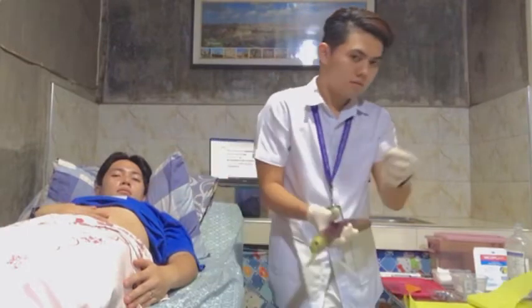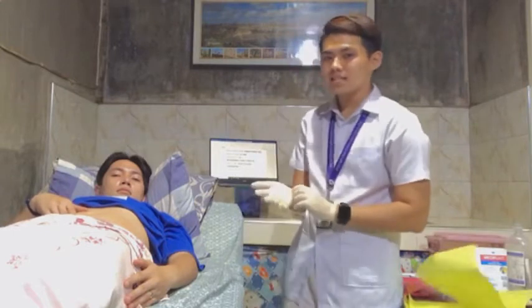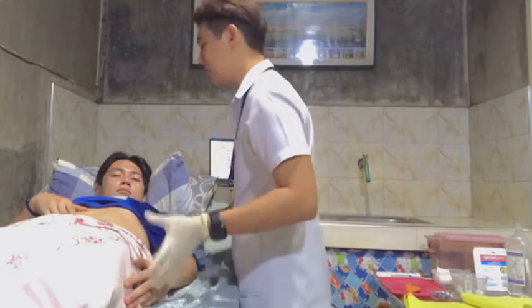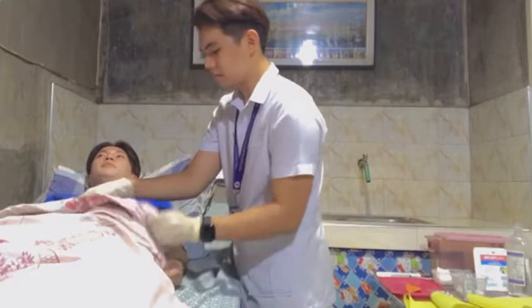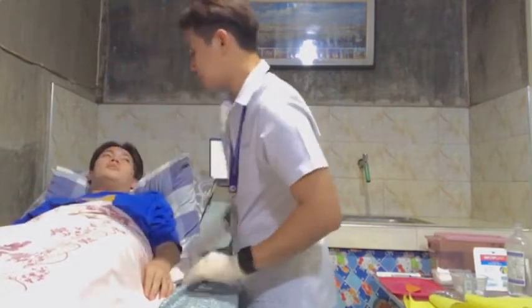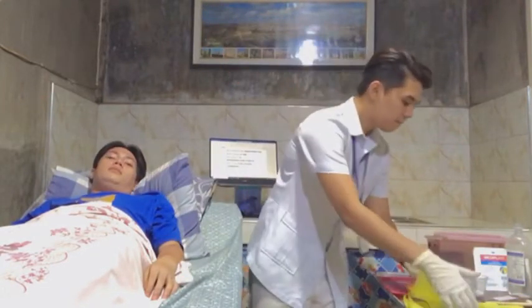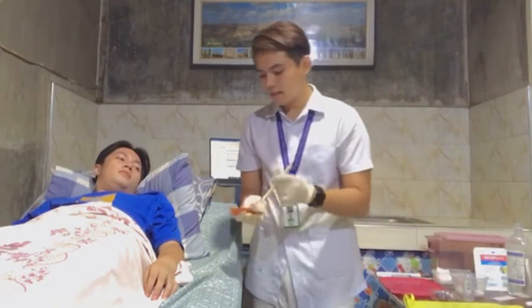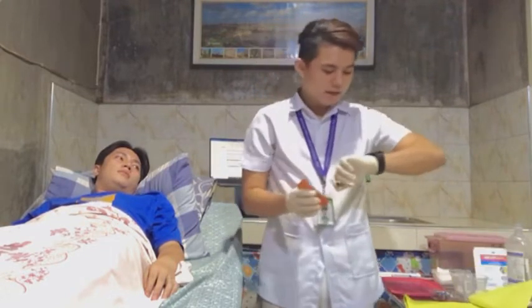Okay, move this one. So, of course, after that, place the patient in a comfortable position and document the procedure after that. Okay, sir, can you please? Do you want to drink water, sir? Are you comfortable? Do you have any other questions? Okay, so lastly, document this one in the medication ticket, and then it's the abdomen, left lower quadrant, and the time is 10 p.m.